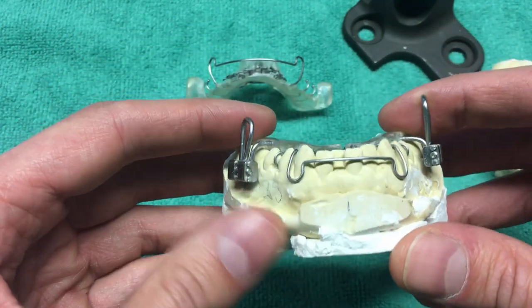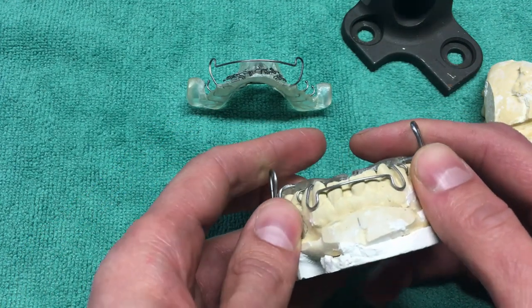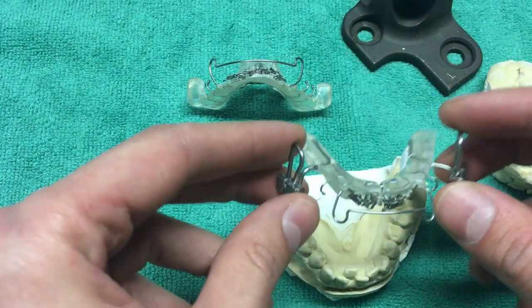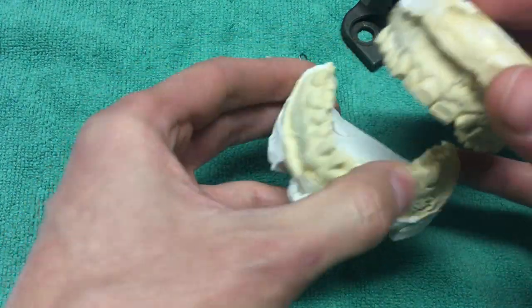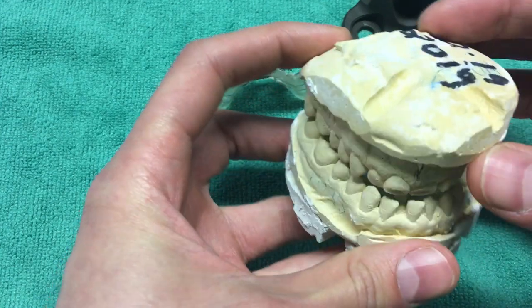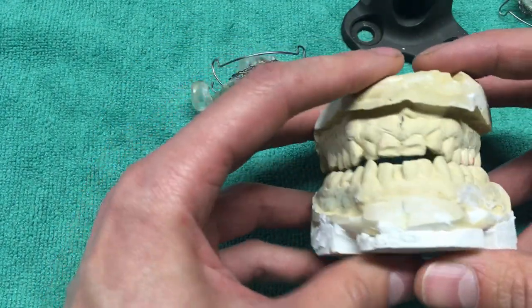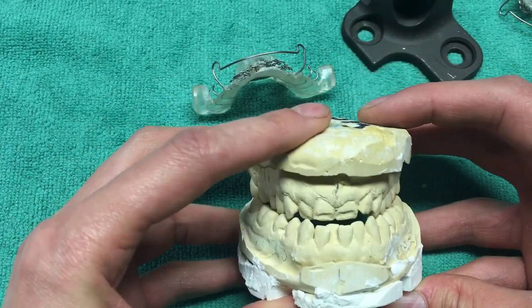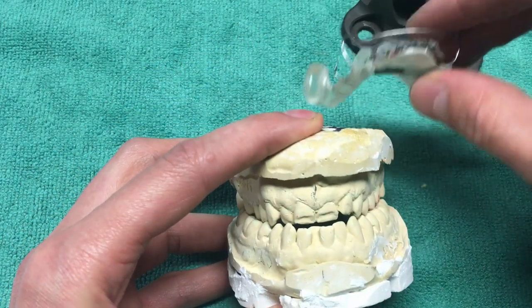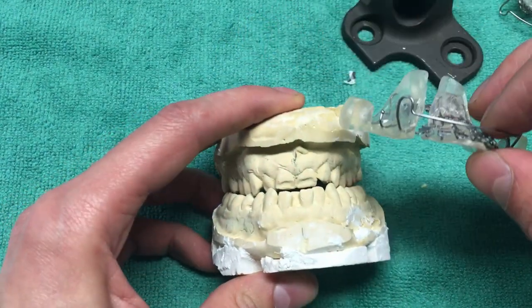My upper jaw is super tiny, and this is a custom-made thing. As you can tell, these are my imprints that I got a while ago, like early February. This will all change — I will get new impressions as the process goes on, because I will need new appliances as my screws get to their limits.